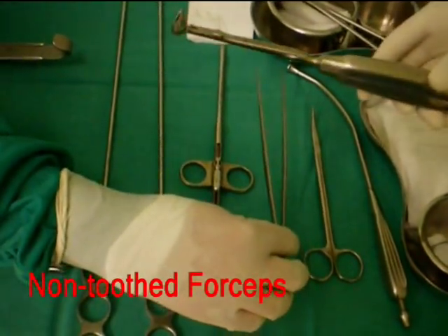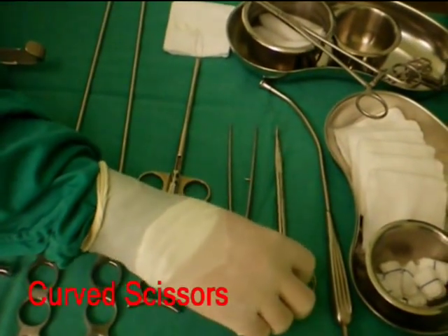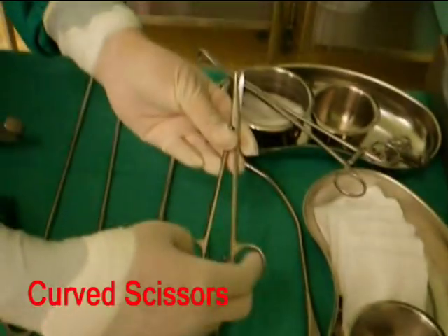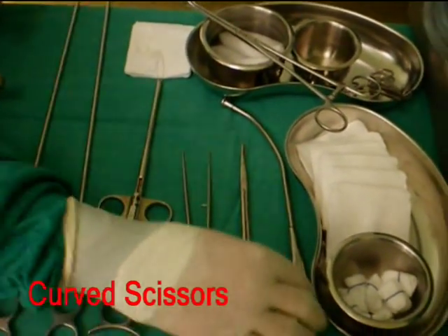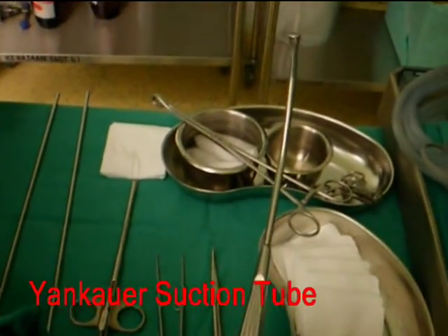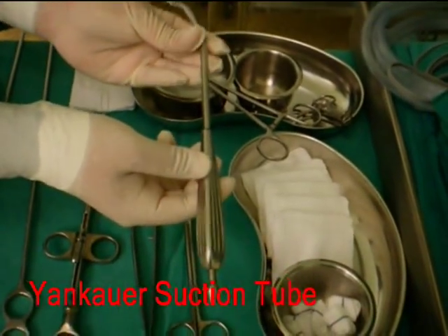A fine non-toothed forceps can be used for a number of purposes in a tonsillectomy. A curved scissors is conventionally used to begin the tonsillar dissection and to define the dissection plane. For suctioning, a Yankauer suction tube is the suction tube of choice in a tonsillectomy.